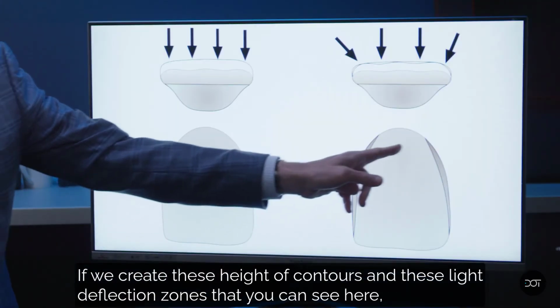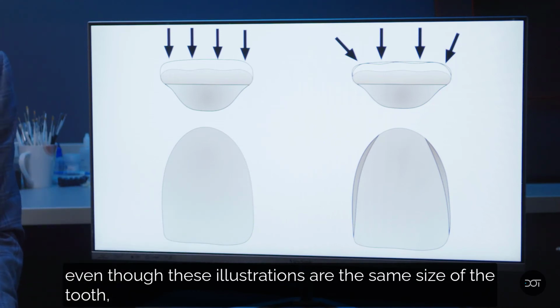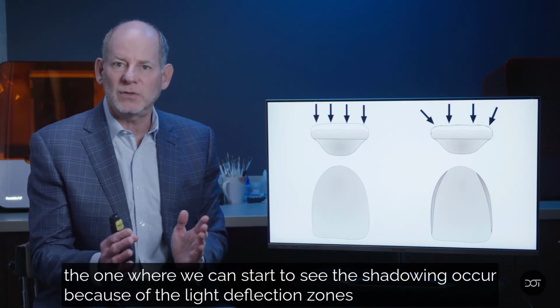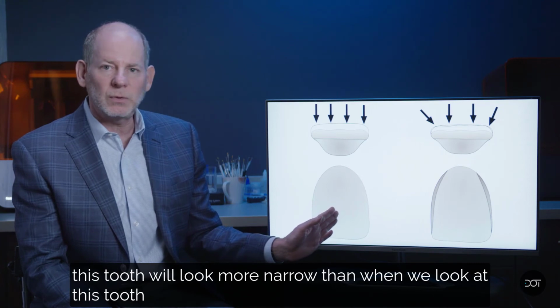If we create these lines or height of contours and these light deflection zones that you can see here, even though these two illustrations are the same size of tooth, the one where we can start to see the shadowing occur because of the light deflection zones, this tooth will look more narrow than when we look at this tooth.